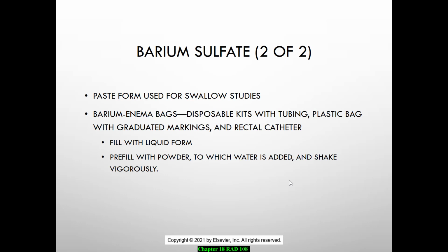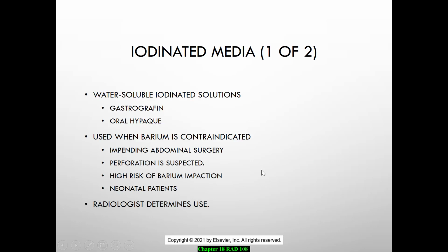Sometimes we have a paste form that we use for swallow studies. Typically, these will be pretty thick because they have to swallow it. So it just depends on what your patient's having done. Sometimes you'll have patients coming into the department where they're checking for the reflex. They're going to have that paste that they're going to swallow.